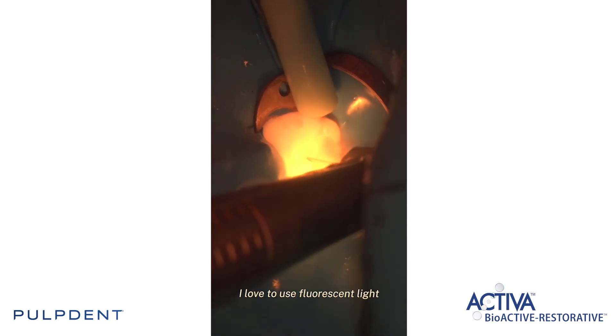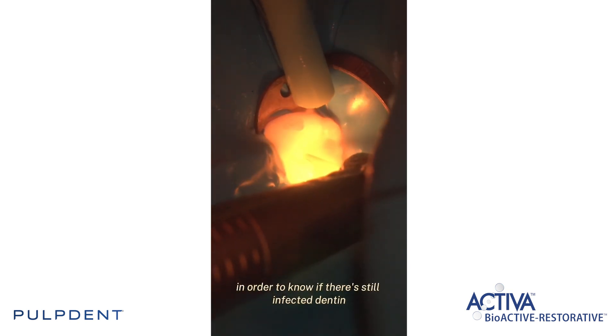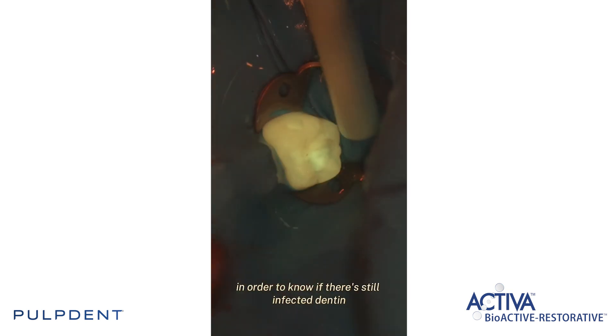I love to use fluorescent light in order to know if there's still infected dentin.